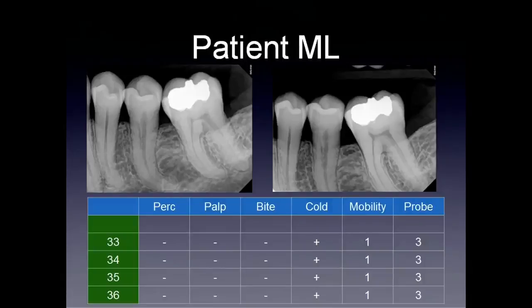Radiographically, we can certainly see that there is something going on on what appears to be the mesial aspect of this tooth, number 3-5, in the coronal middle third. Traditionally, we're taught to take off-angle radiographs, as we've done here, to help us try to discern if it's an internal versus external resorption. In this case, it doesn't appear that the lesion moves with our off-angle, and so one might conclude that it's an internal resorption.